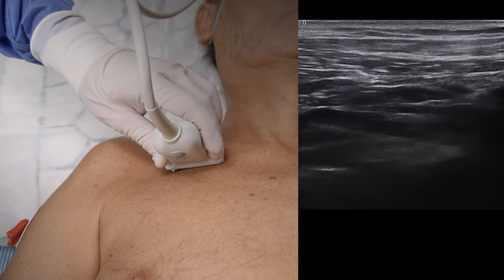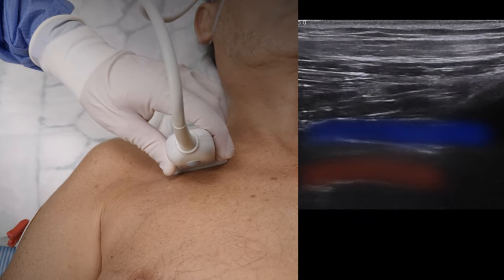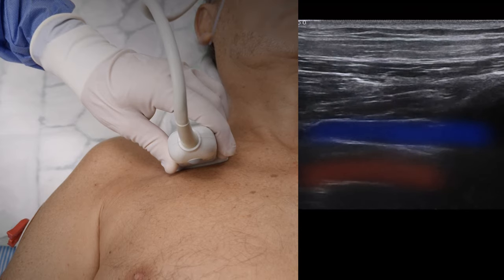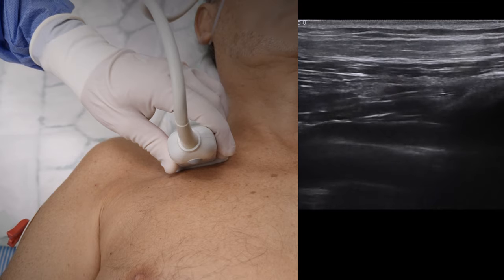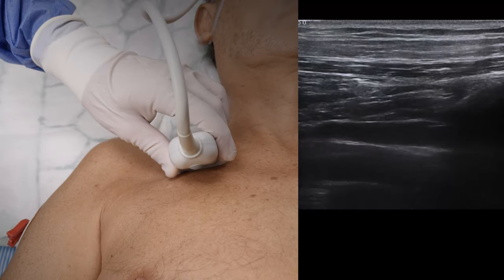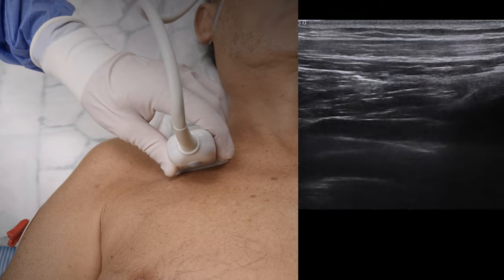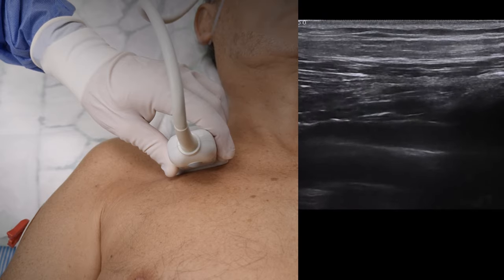Tilt cranially until the subclavian vein and artery come into view, here highlighted in blue and red respectively. Note that it's not always possible to achieve a view where both vessels are visible at the same time, but it's vital to identify both in order to avoid an accidental arterial puncture. The artery usually pulsates and is located deeper, more cranially, while the vein is shallower and expands and contracts with the respiratory cycle.